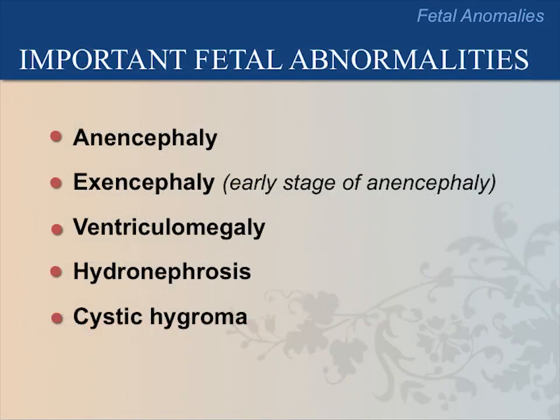These are the abnormalities which we will discuss in this lecture. Anencephaly, exencephaly, which is an early stage of anencephaly seen in younger fetuses, ventriculomegaly, hydronephrosis, cystic hygroma. Please pause the video now to practice saying each word with your instructor.